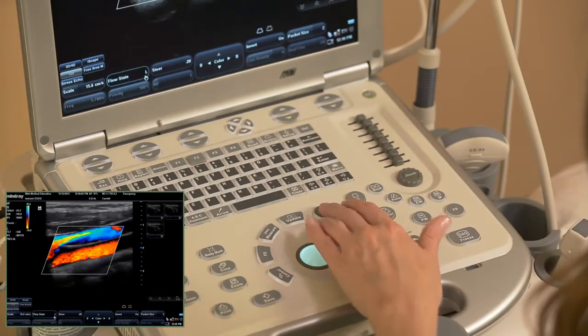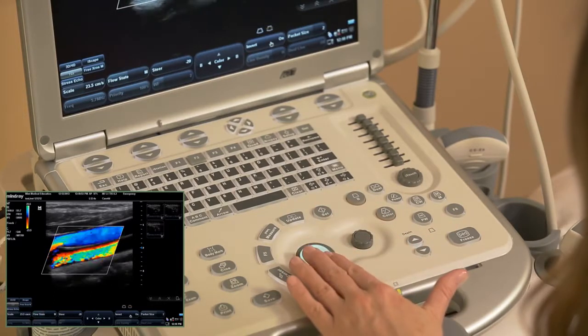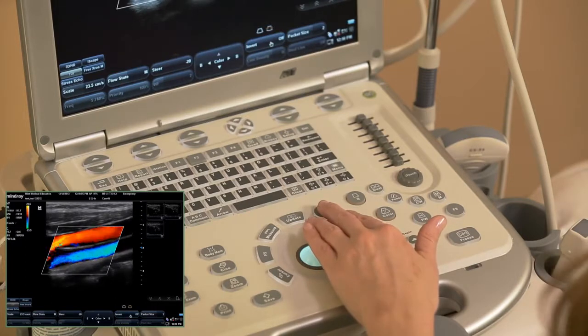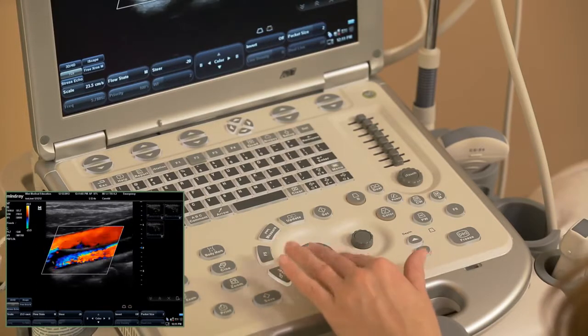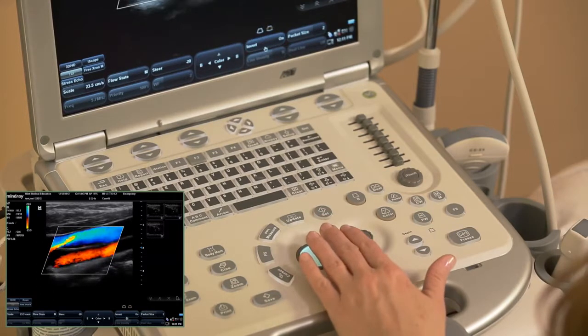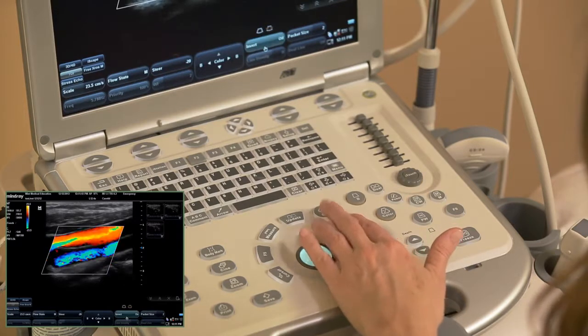Yeah. So steering we did. Let's move across these. Oh, inverting the color. Yep, and so invert, when you do that, it allows you to, depending on which way your box is steered and how your orientation to the vessel is, you'll see that it changes the direction of flow. Okay. This will tell you when that's the normal setting, and then this is inverted, so on and off. Yep, okay. You got it.